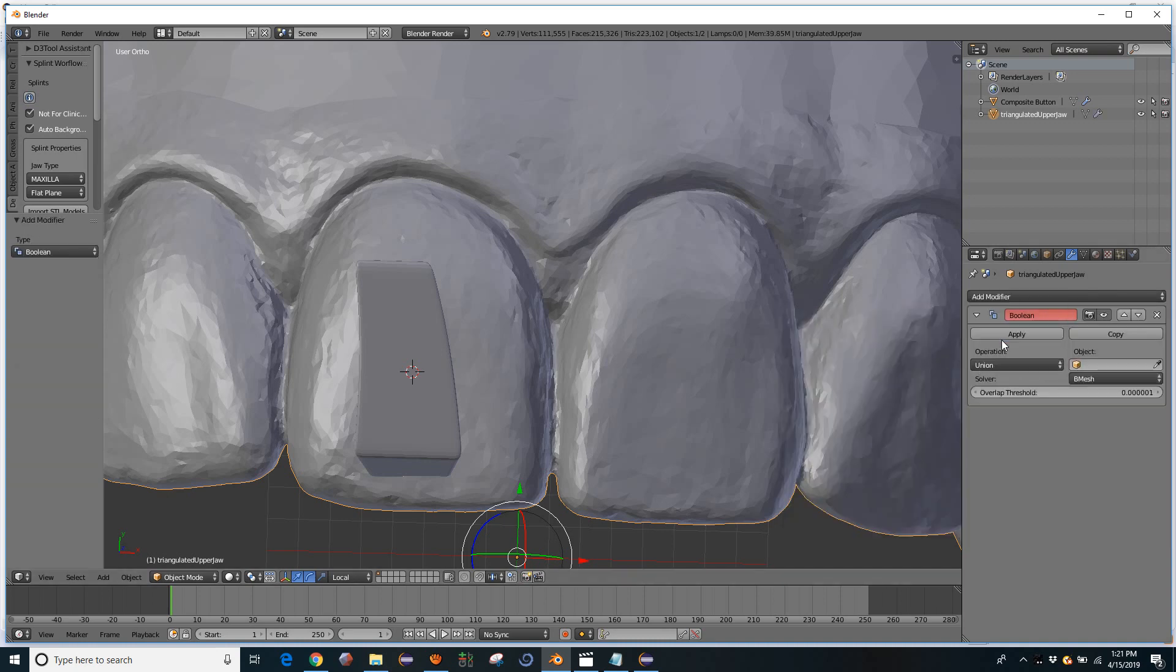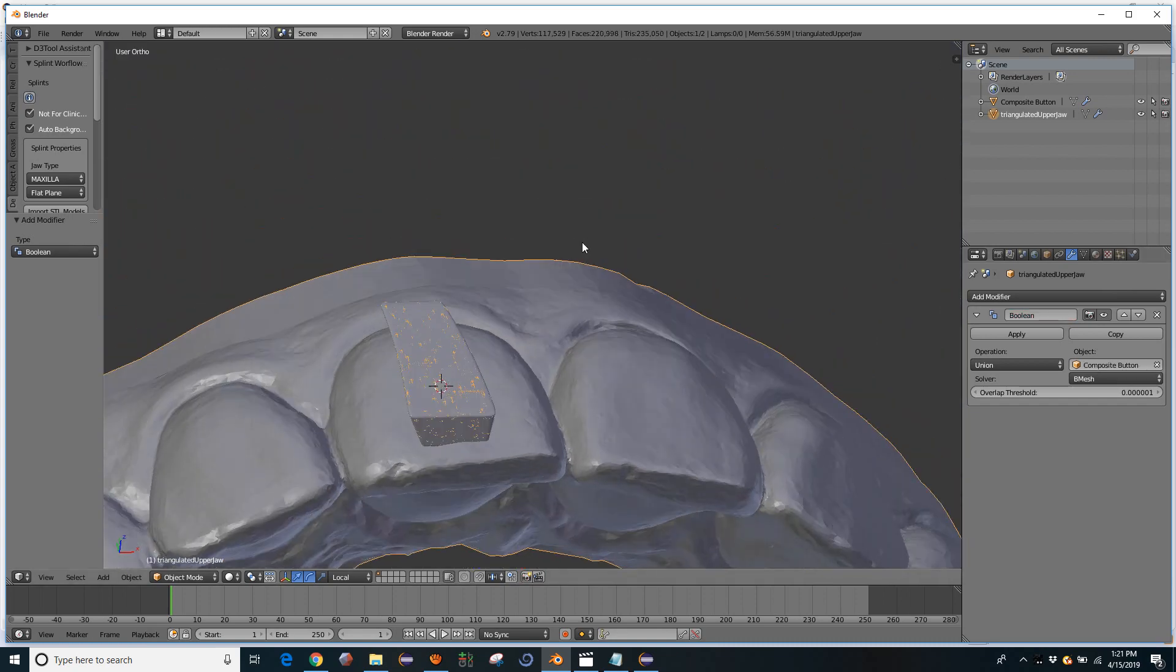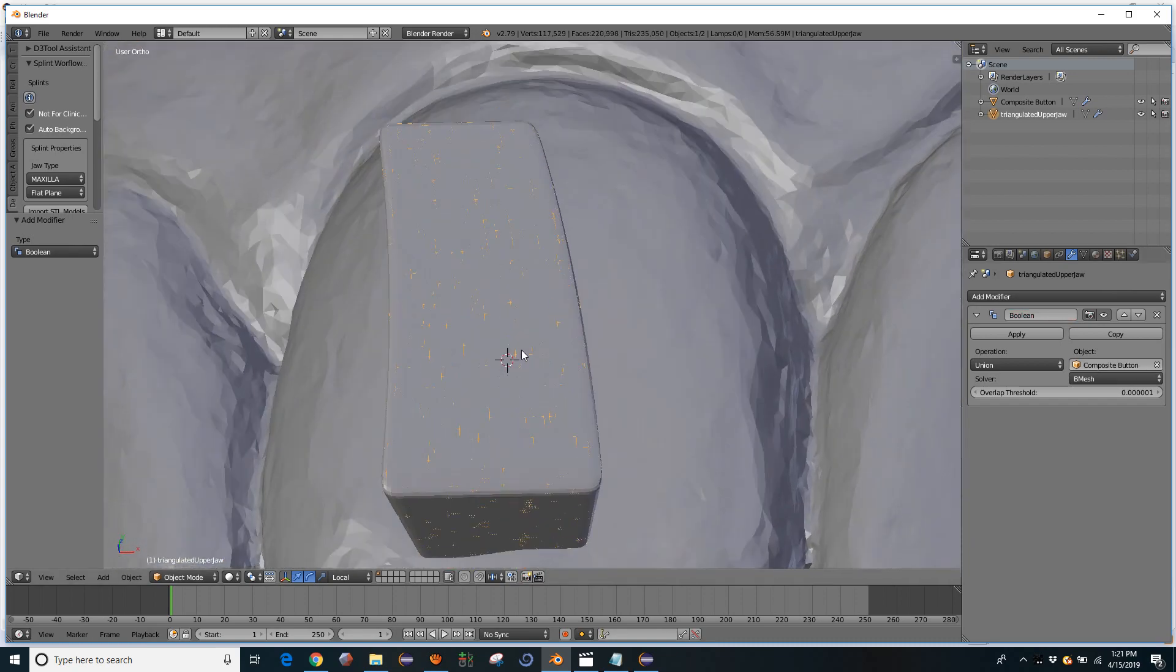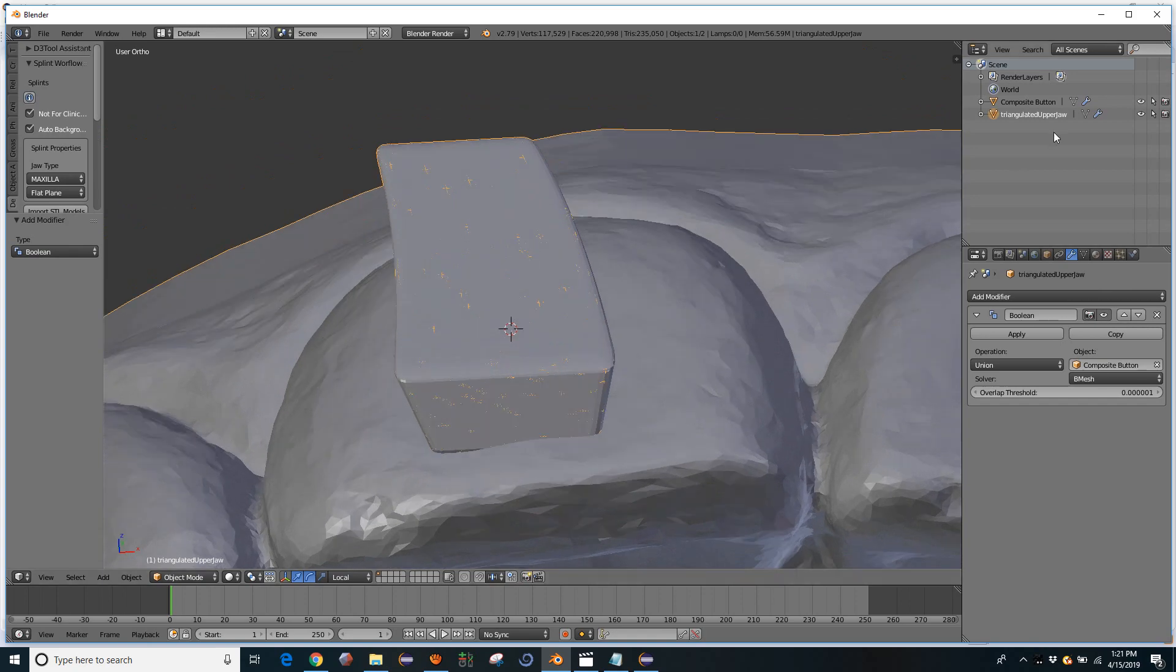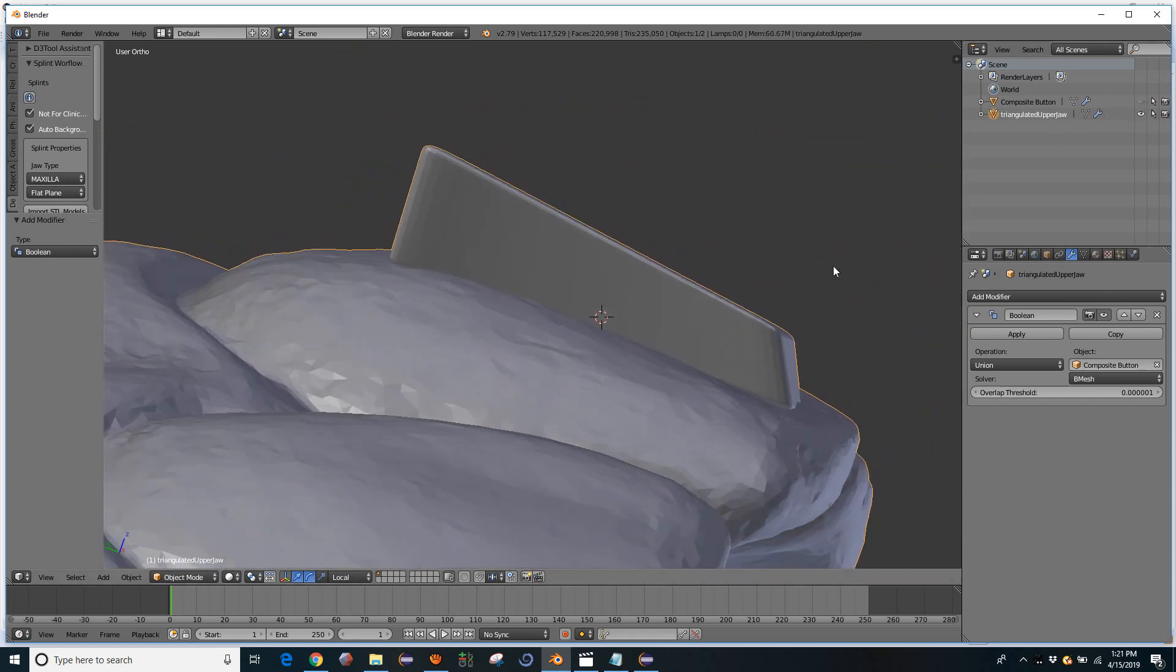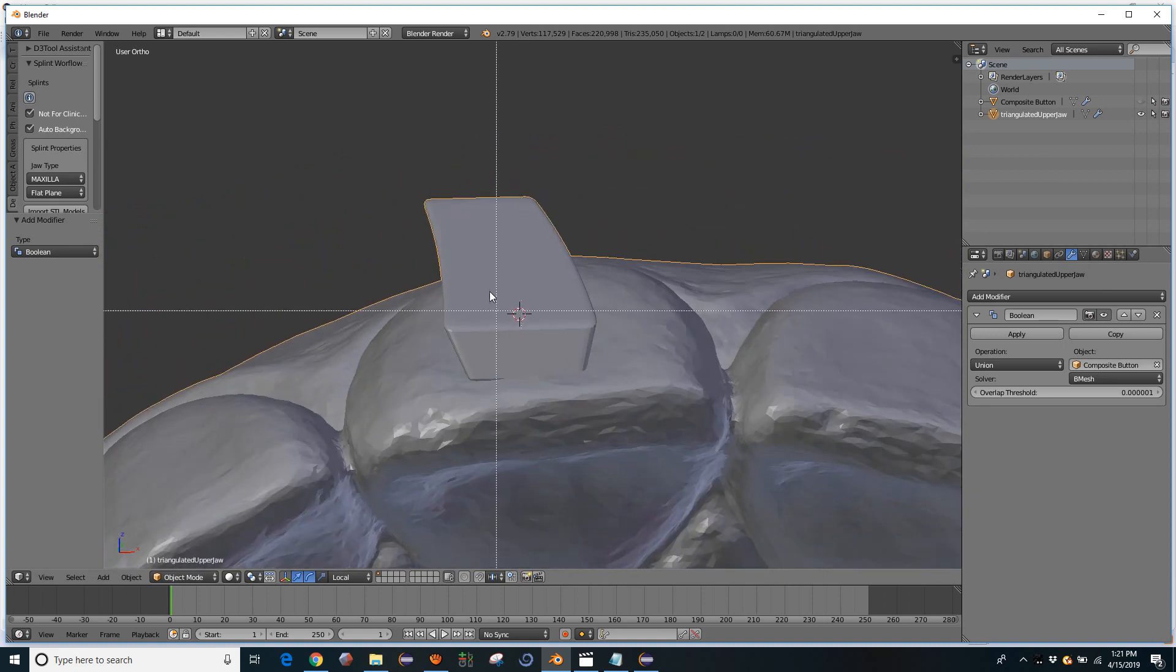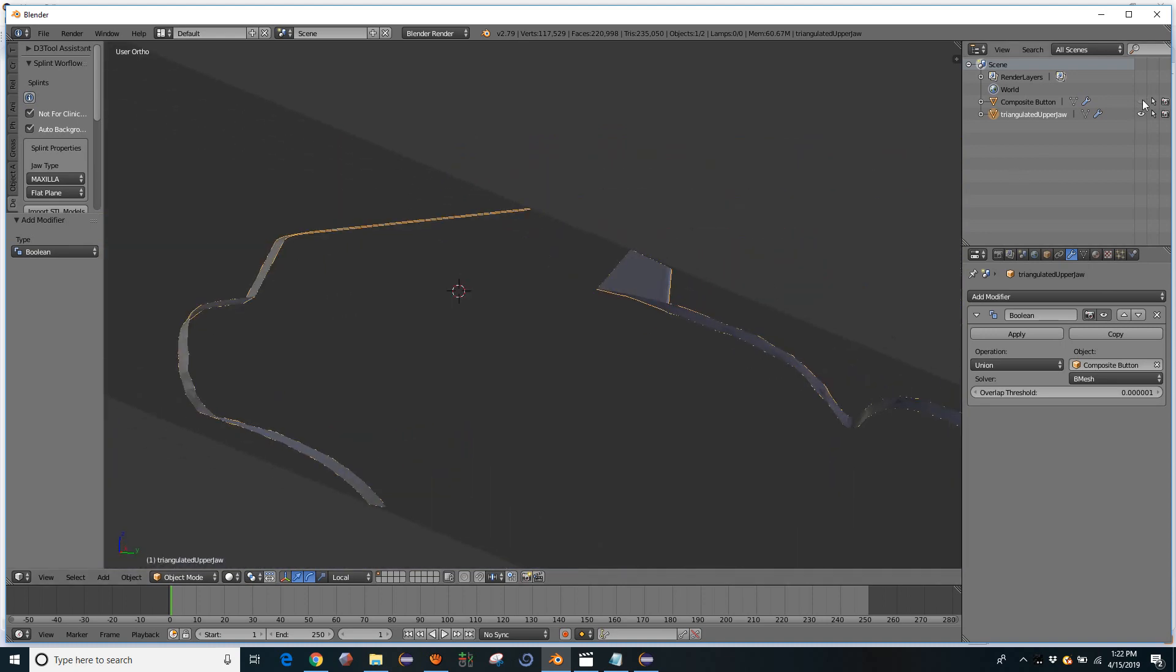We're going to have a union of these two objects. And the composite button is the only object in the scene. But what we could do is use this little dropper and then left click on the object we want to join it to. You'll see it will get this little sparkly look and that's because the composite button is now joined in there, but leaving a copy of the original object.